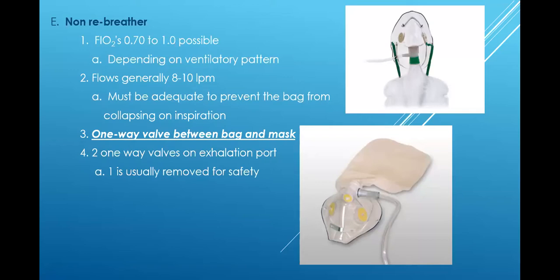Show me an aerosol face mask. Show me an aerosol T-piece, aerosol trach collar, right? That's what we're getting ready to get into now. You have to be able to put that stuff together. Everything will be on the table for lab, and you have to be able to get it and put it together and turn it on right, okay? You're going to have to be able to tell me the flow that's coming out of there, the total flow that's coming. What is the patient's demand, right?